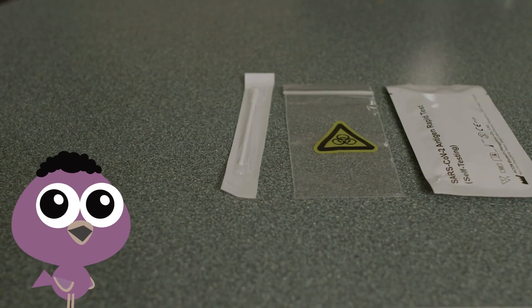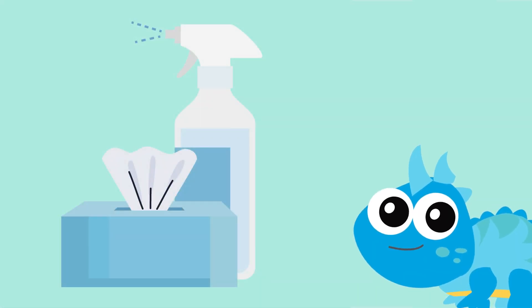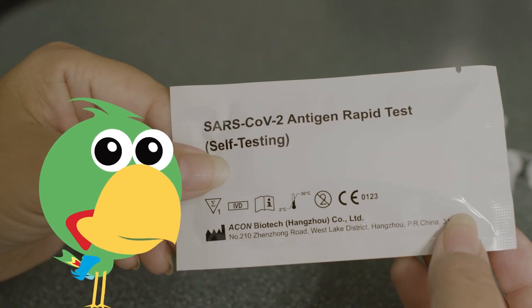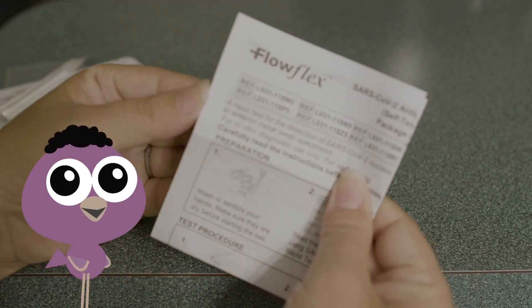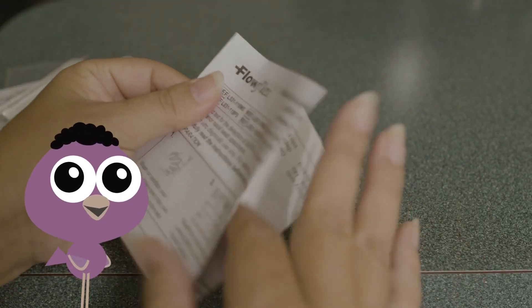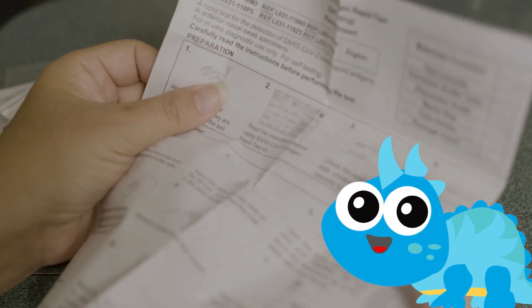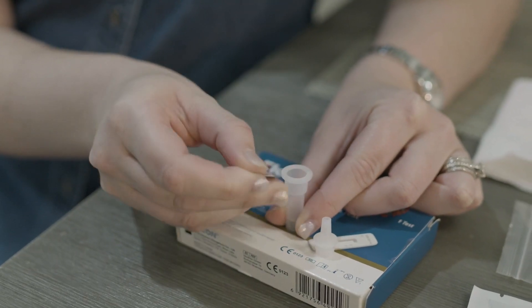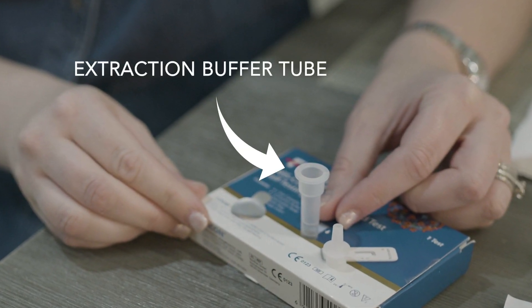Open your kit and lay out the contents. Make sure you get a box of tissues or some tissue paper. Check the items from your kit to make sure nothing looks broken, missing, or damaged. Read all the instructions for your test before you do anything. We use the FlowFlex test, but most lateral flow test instructions go something like this. Step one: remove the cap from the top of the extraction buffer tube.